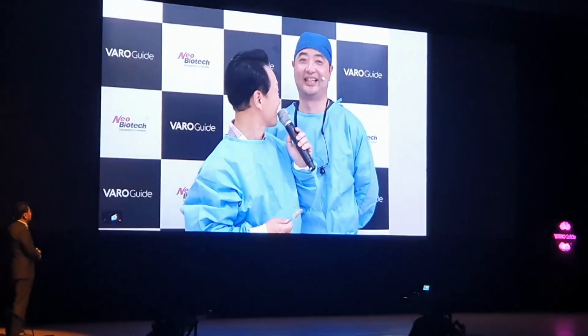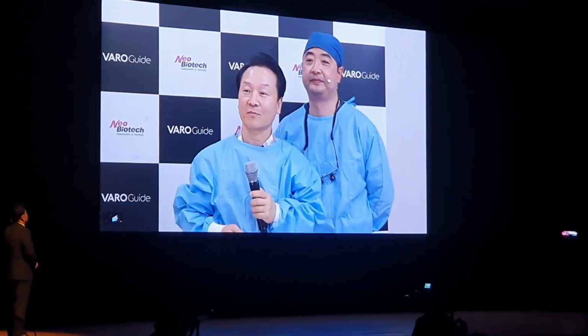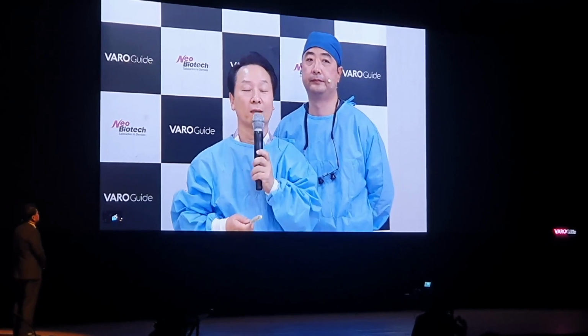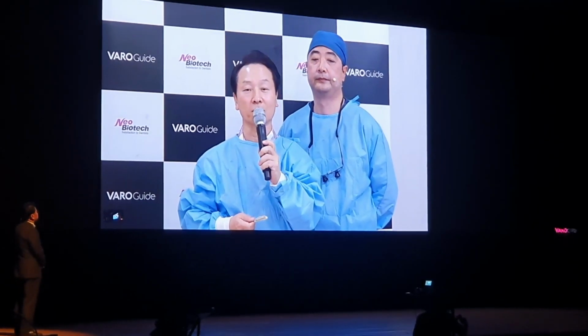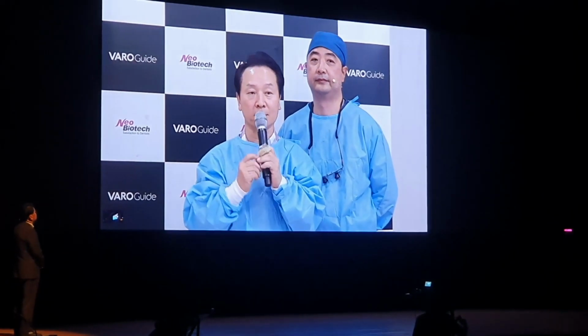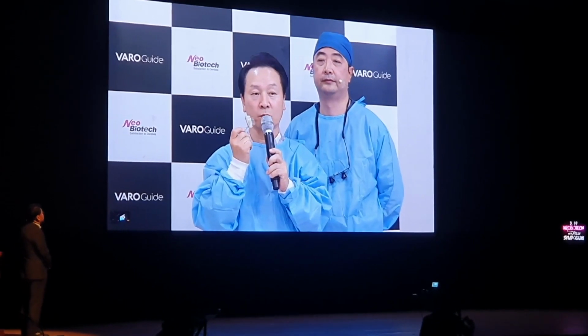Then as a patient, can you tell us a little more about the advantages of the VARO guide? Well, I mentioned them all in my lecture, but first the guide was very stably fixed inside the mouth, so I didn't have to bother holding it.